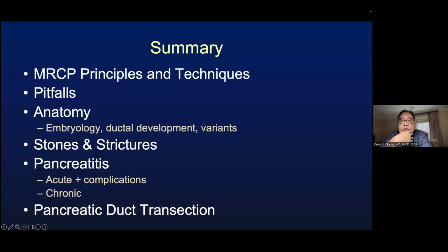I think the main use that I use for dual energy CT is just better accentuating the enhancement pattern of the pancreas, particularly on the low KEV images or on the iodine maps. I think it also is a great way to look at the vessels, especially the arteries and veins, making sure that they're patent in the setting of pancreatitis. I'm not sure if I use dual energy much in the evaluation of chronic pancreatitis.